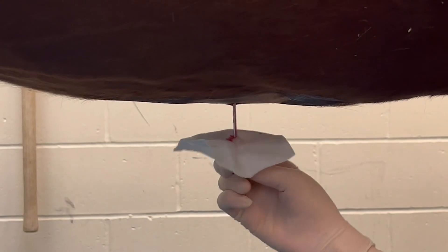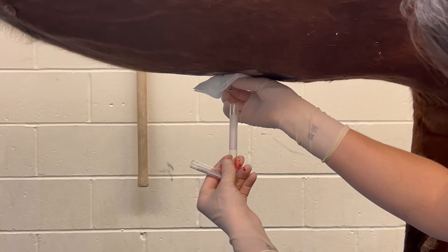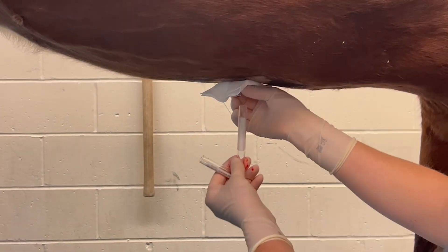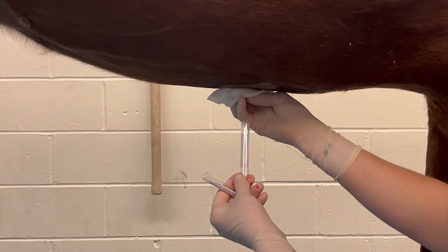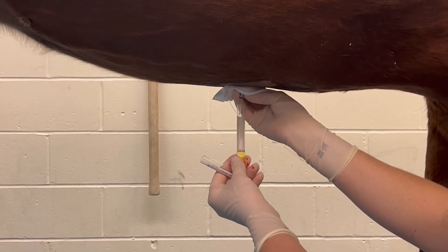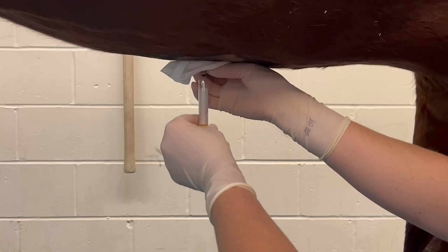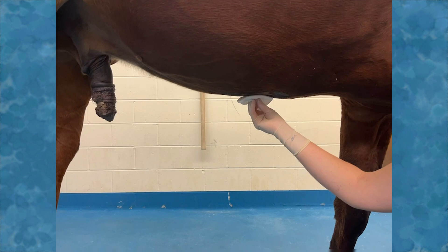The blade is removed and the T cannula should be quickly placed into the hole and advanced to the hub. There will be mild resistance as the cannula penetrates the peritoneum. Abdominal fluid should then flow freely out of the cannula into the collection tubes. You may have to rotate your T cannula to allow fluid to flow. If only a small volume is obtained, hold the collection tube below the cannula as it is withdrawn to catch any remaining fluid. Once removed, a gauze square can be used to hold pressure at the site.